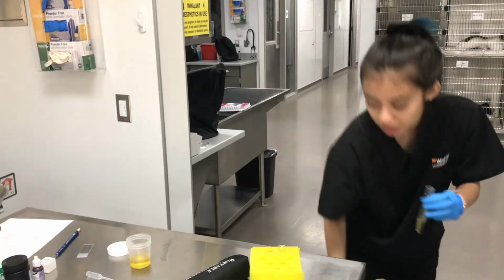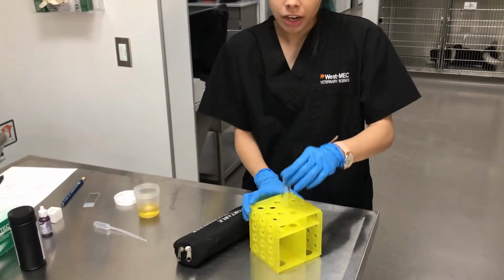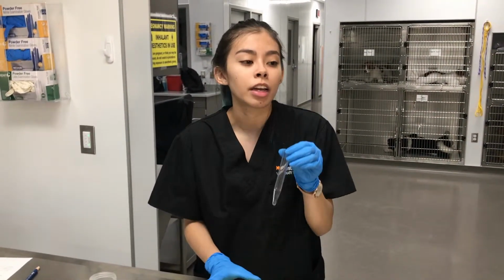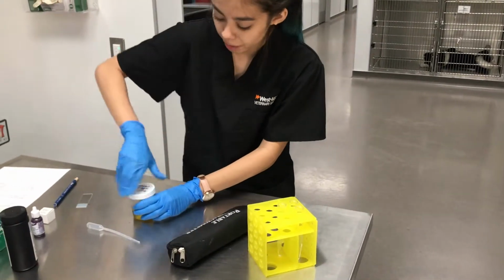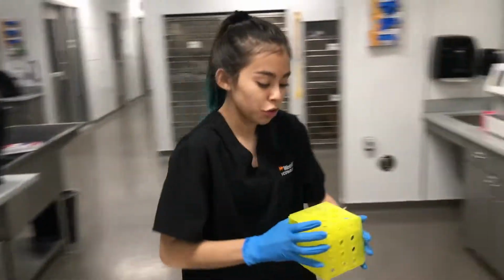So I'll dispose of this pipette, and I will take another conical tube with the same amount of water so I can balance it out in the centrifuge. So once I'm done with that, I will close my urine sample, and I will take these two conical tubes into the centrifuge.